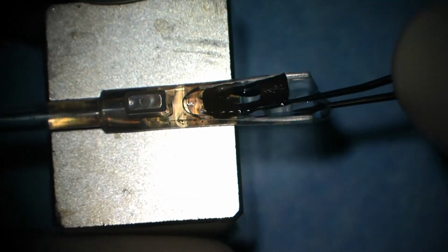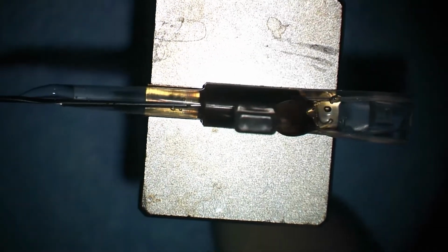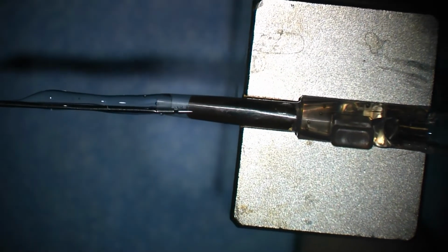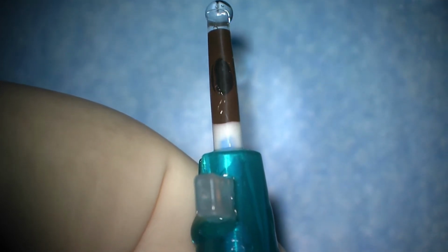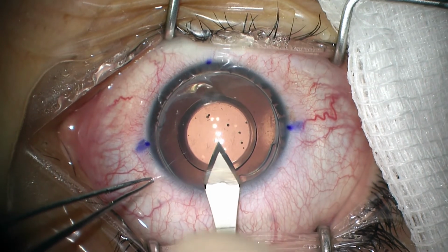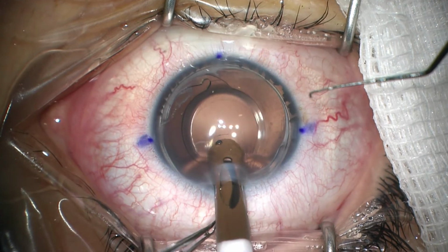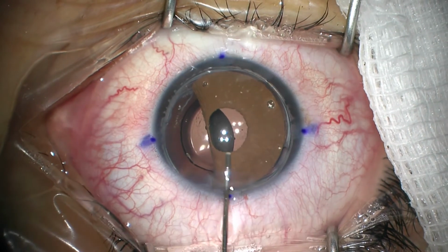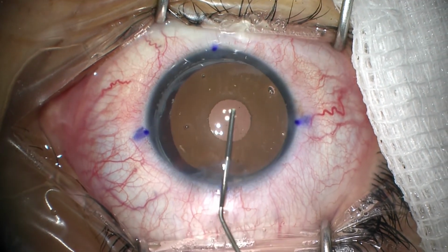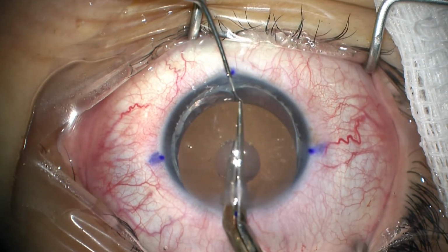Place the artificial iris in an ICL cartridge. Perform a 3 mm corneal incision. Inject the artificial iris into the anterior chamber. Make a radial cut of the iris with Vannas scissors.